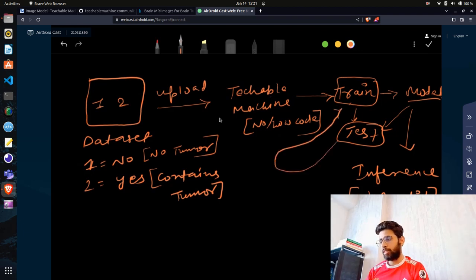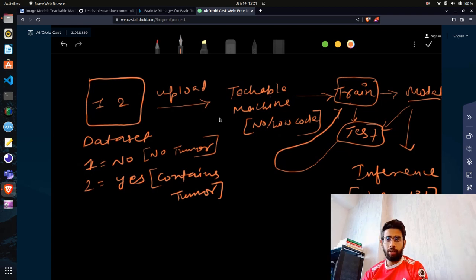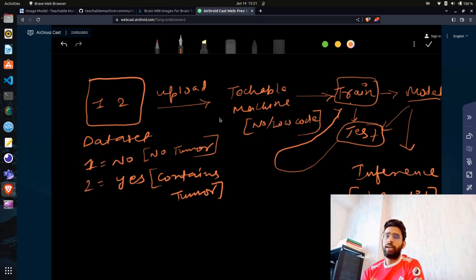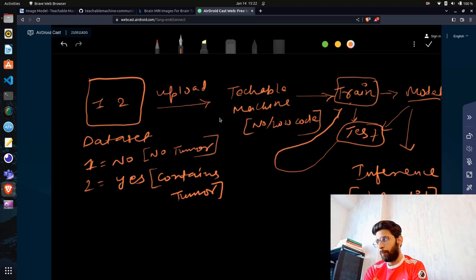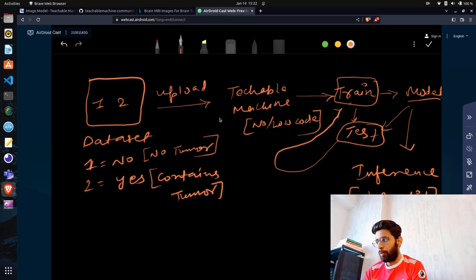Remember it's a binary classification problem, so both classes should be balanced. If you have 100 images for 'No' and 500 for 'Yes' without augmentation, your data will be biased. Also, never use accuracy as the evaluation metric for a binary classification problem — always go with precision, recall, or use a confusion matrix to evaluate your model.